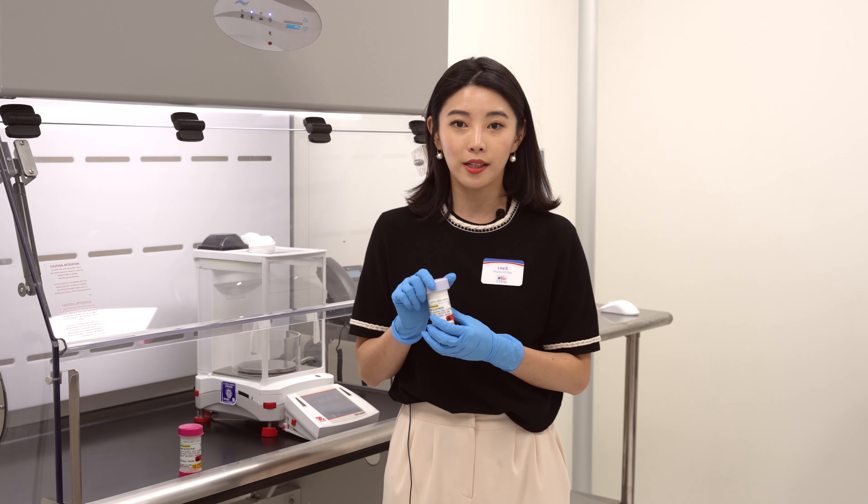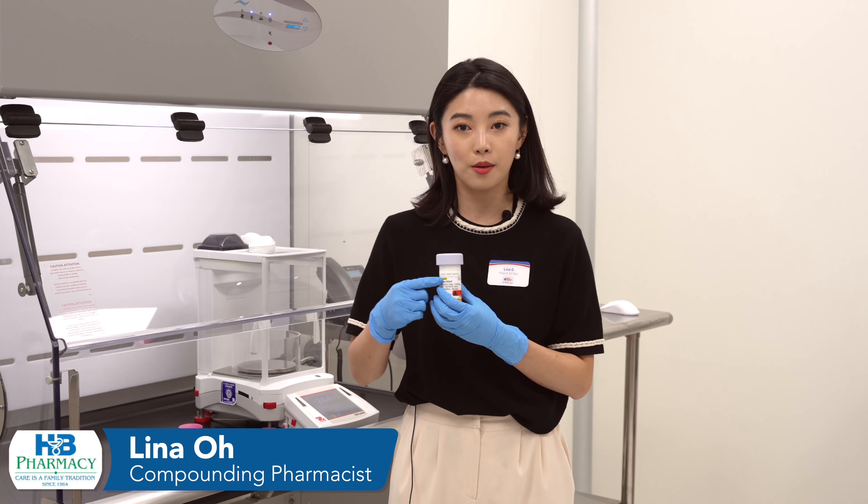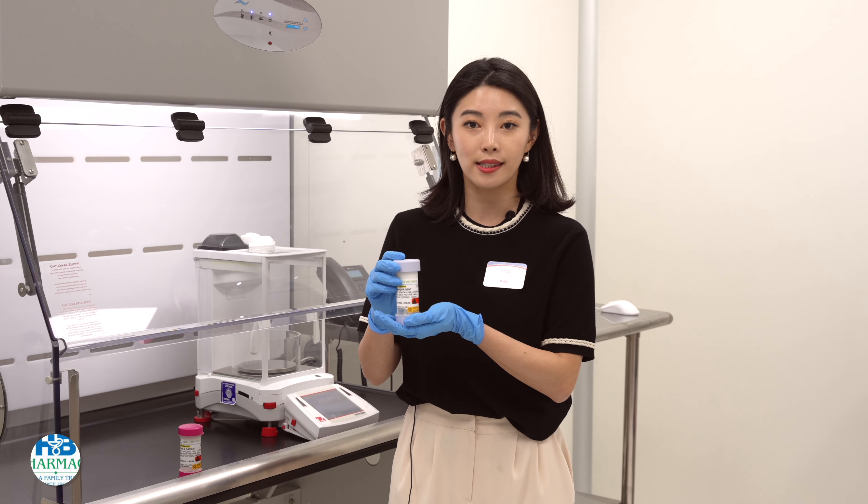So once you get your prescription, each of your doses will be written on the instruction label, on the prescription label. So in this case, we have to apply four clicks topically.